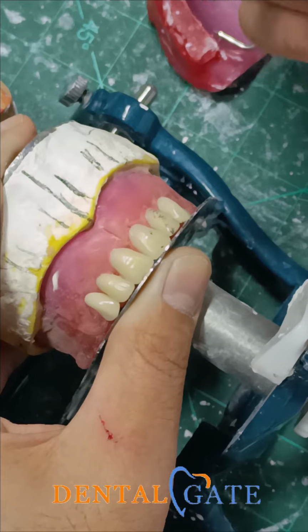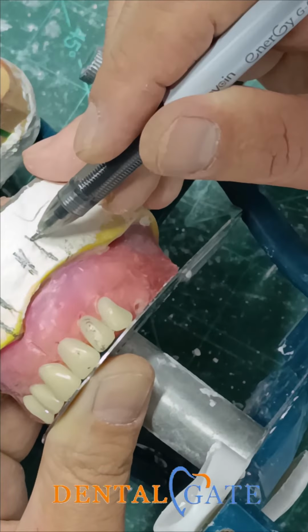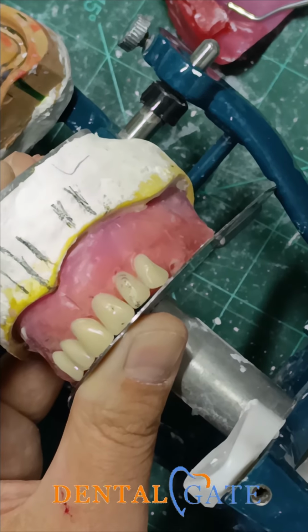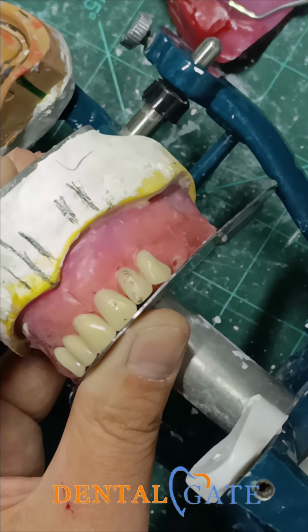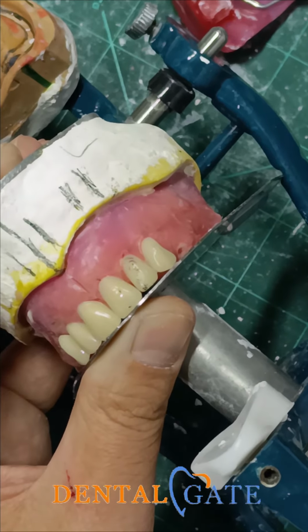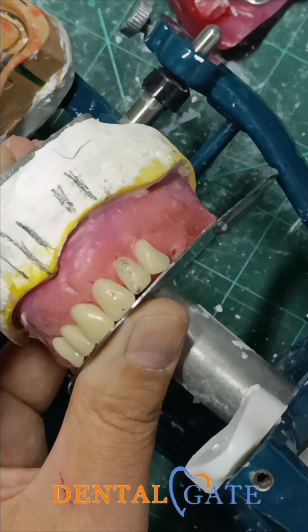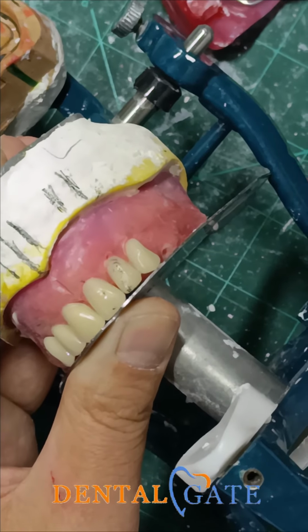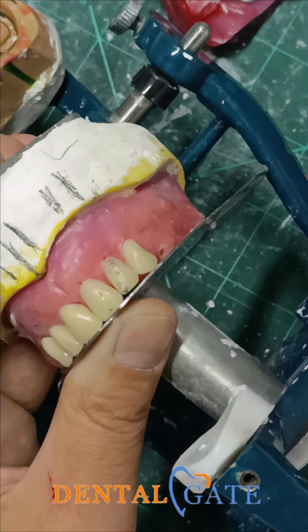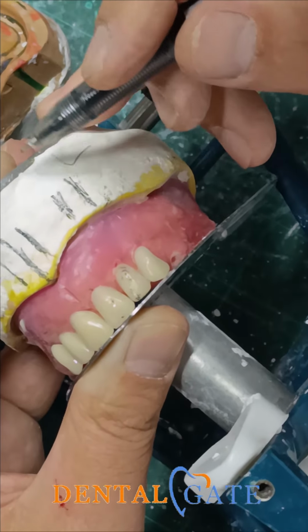Protruded labially, okay? Regarding the canine, please don't make any inclination in the canine. Instead, the shape of the canine will reveal the inclination, not the arrangement. The long axis of the canine, the anatomical shape labially, reveals that there is an inclination in the canine. So make it within the vertical axis, okay?